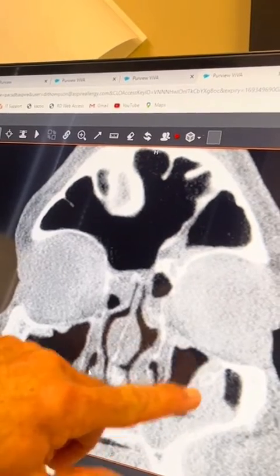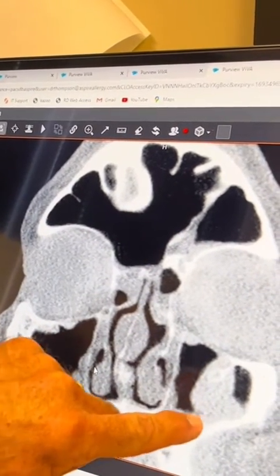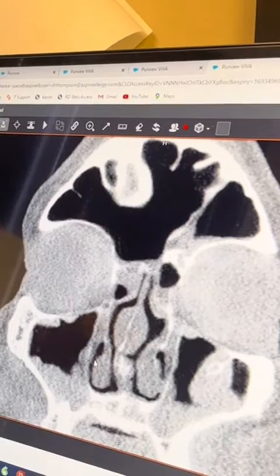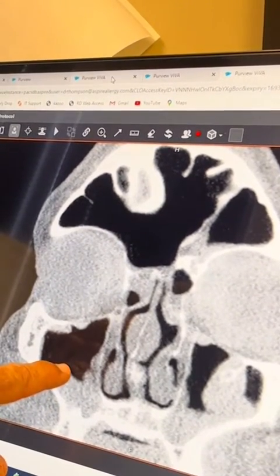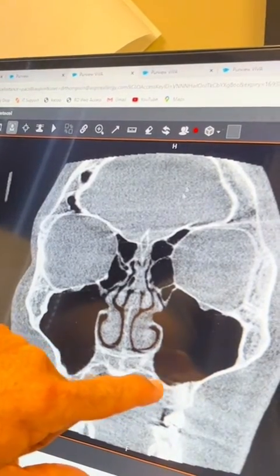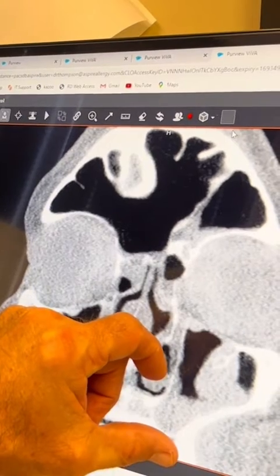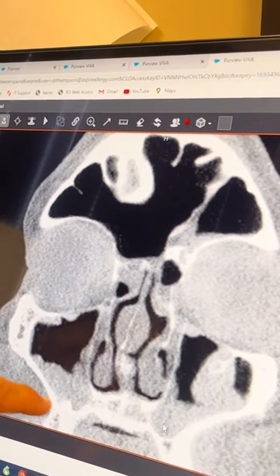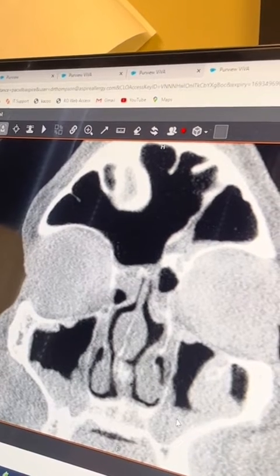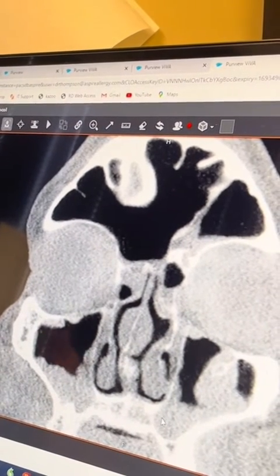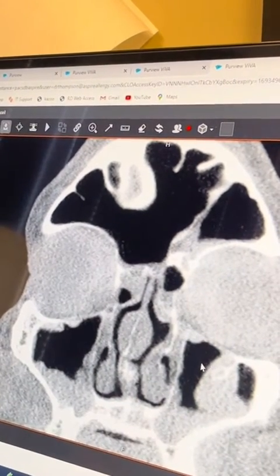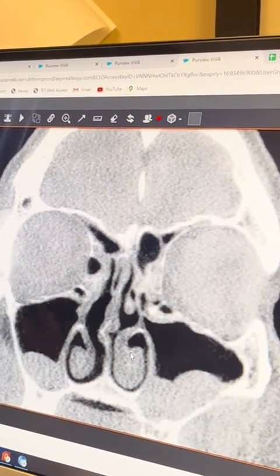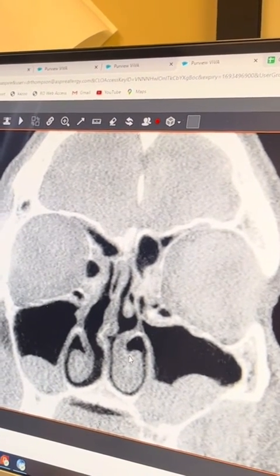They've got tons of this gray stuff in their sinus. Most people think that's mucus, but it's actually the lining of the sinus. The sinuses have a lining — a skin — and normally it's so thin you can't even see it. When the skin gets inflamed and infected, it gets thick and swollen, just like the skin of your hand would if you got an infection. It starts to become visible on a CAT scan, at which point it's about 50 times its normal thickness. At this point medications don't really fix this — it's clogged. His drainage pathways are clogged up, so he's just destined to smolder and deal with this until we fix it.